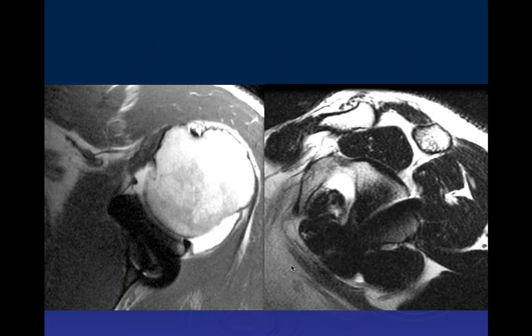Oh, okay, perfect. So we have an axial T1 and sagittal T1 images here. Yeah, this is T2. Oh, T2, okay. There is a dark signal overlying the glenoid. Presuming that's a surgical repair. And here are the coronals.